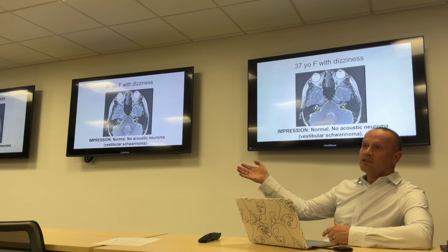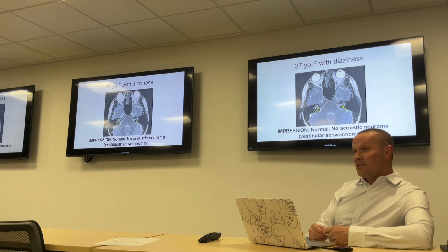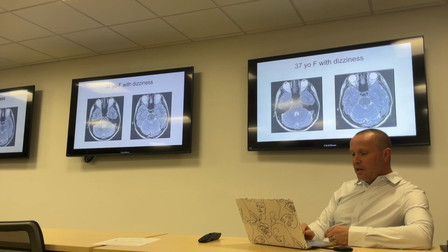I signed it off, I went on to the next case. Well, I found out quite a bit later that there were actually more findings on this study that I didn't see initially. And so as I went back and looked at it again, now mind you, this wasn't a whole brain MRI, this was just looking at the temporal bones, but when we do that, we can see a little bit of the brain and the brain stem.